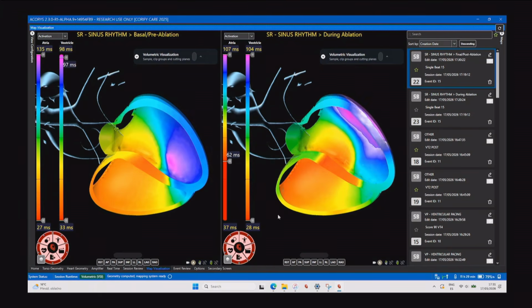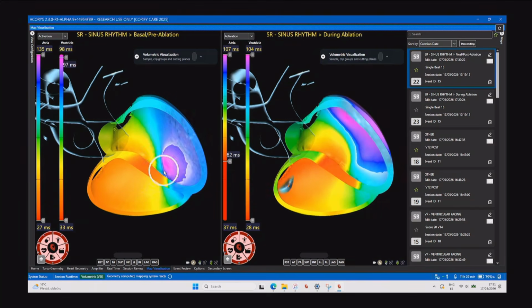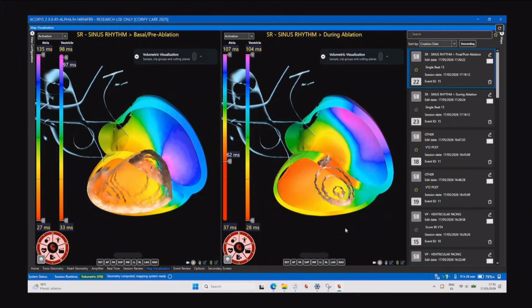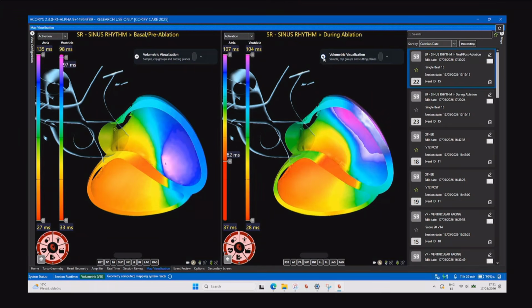Can you put the mouse in the area of interest, Esther, please? Here, exactly. And if you see here now, the conduction is much faster. So that's the plan, to be sure that there is nothing else in the apical channel. Move to the inside, please.